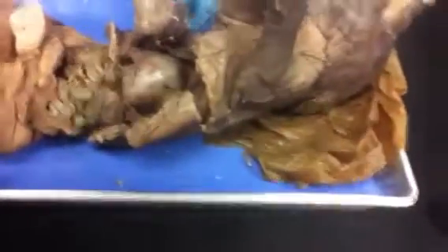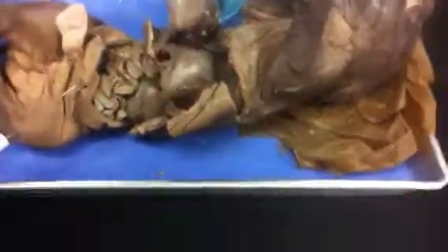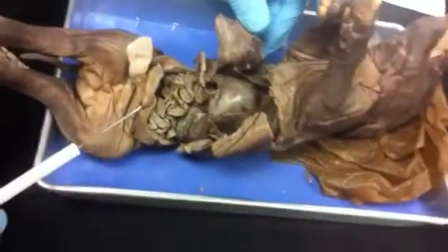Okay, we've got Max and Jordan here. Our pig's name is Abigail. She's a female. Approximate age is 100 days.